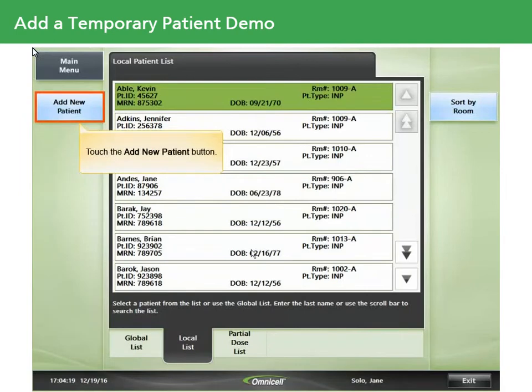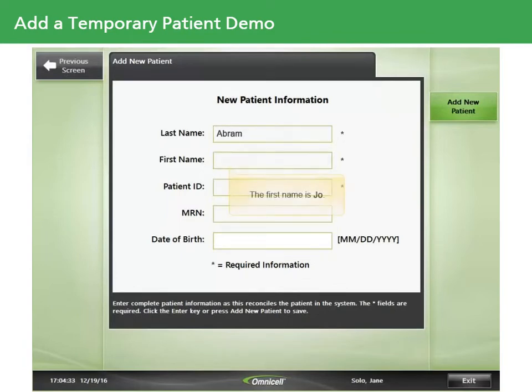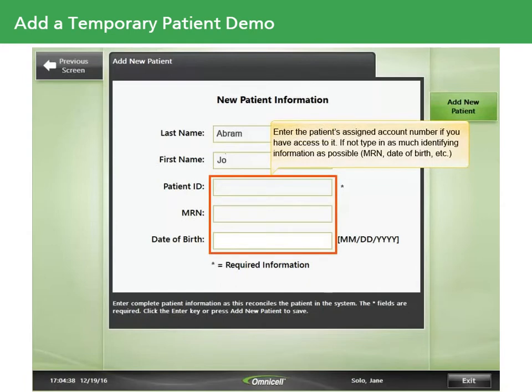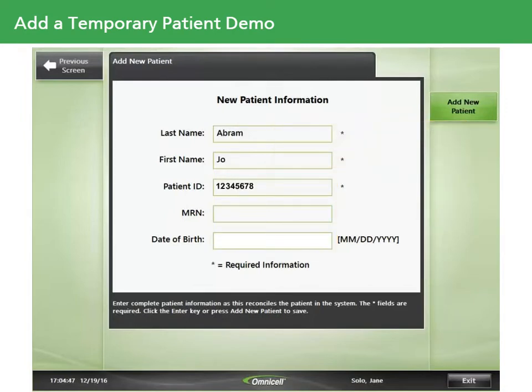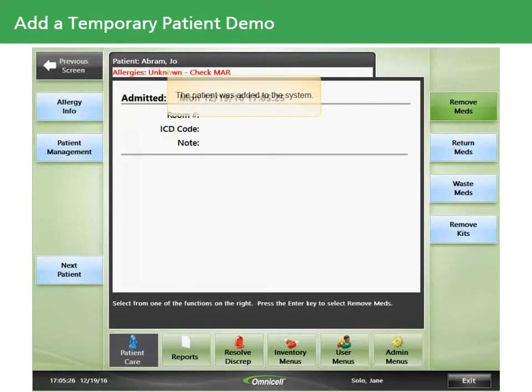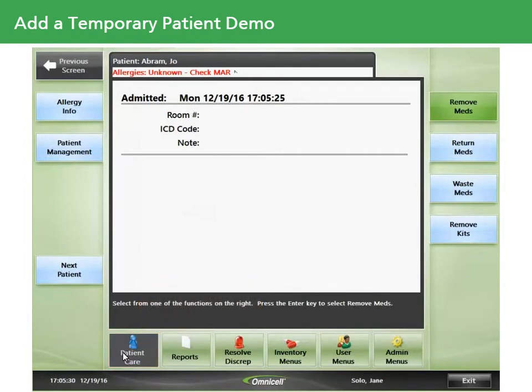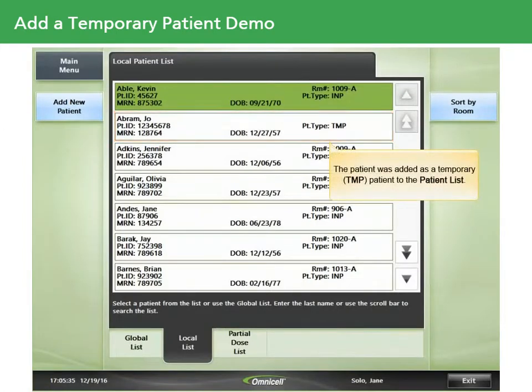You'll be prompted to enter the new patient information. Our patient's last name is Abram and first name is Joe. Enter the patient's assigned account number if you have access to it; if not, type in as much identifying information as possible, such as date of birth. Touch Add New Patient. The patient's screen appears confirming the patient was added to the system. Touch the Patient Care button to return to the patient list. The patient was added as a temporary TMP patient to the patient list.